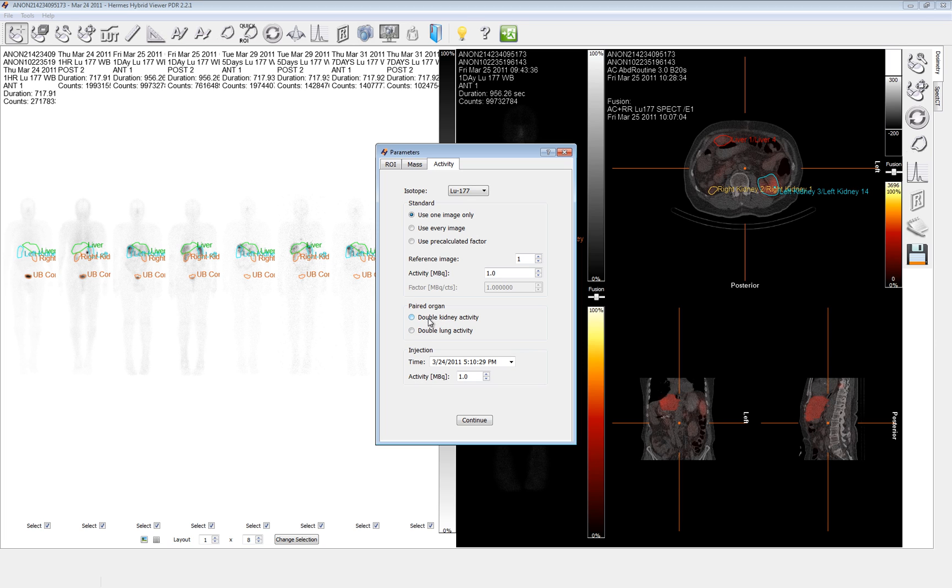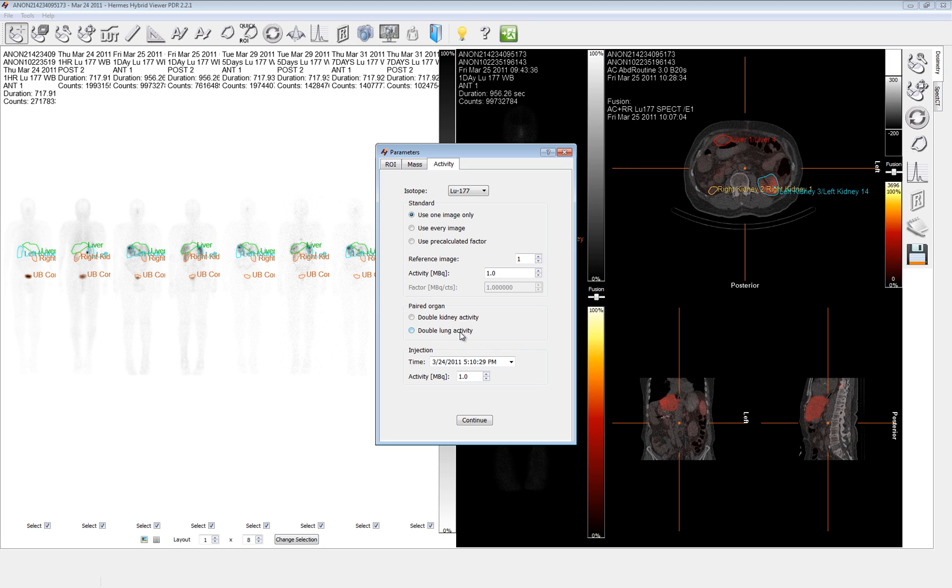We've got a paired organ area. This allows you to double the kidney or the lung activity. The only reason for this is if the patient has post-operatively or through some other means lost a kidney or a lung. These are doubled then because the MIRD phantom expects two. If you have only the left kidney's activity and you split that in the phantom across the left and right kidney, it'll be half the concentration. So what we do is we double that kidney activity. We get twice divided by two and we end up with the same activity concentration which is the important part.